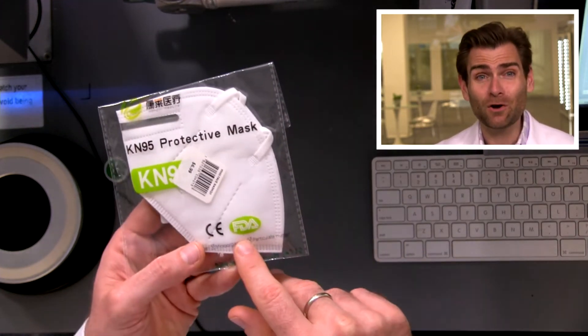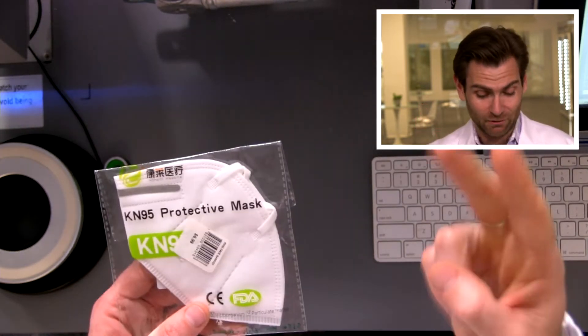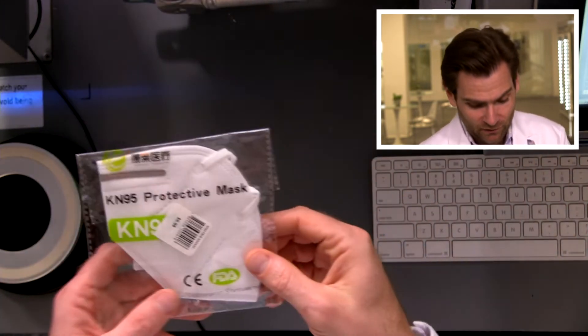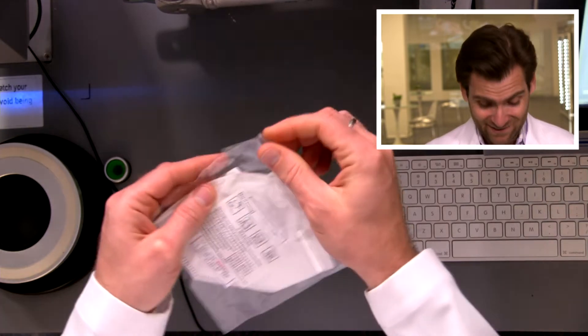Also, it has the FDA's old logo, which is wrong for two reasons. Number one, the FDA doesn't let you put their logo on packaging, and number two, if they did, they'd want you to use their current logo. So this is like someone who's counterfeiting things and is really bad at it. Or maybe they did it in the past, but I'm excited to test this.